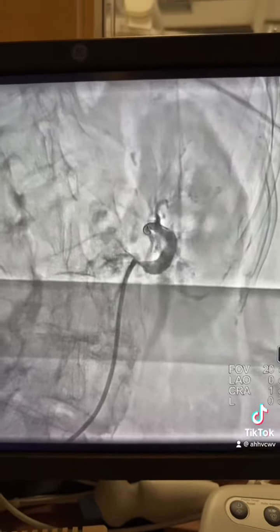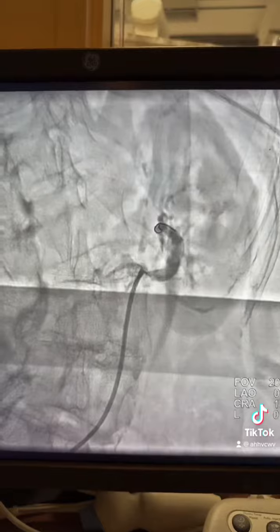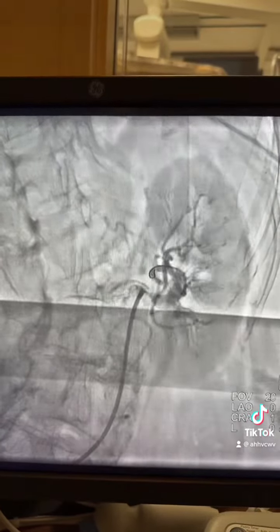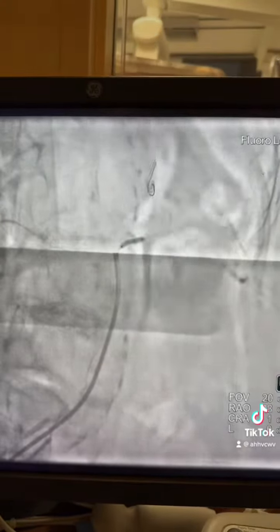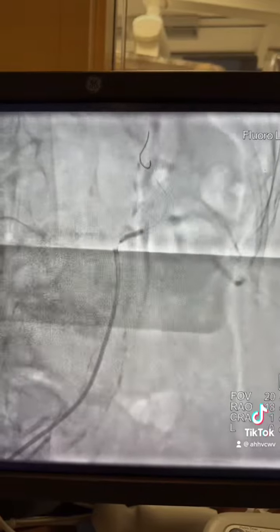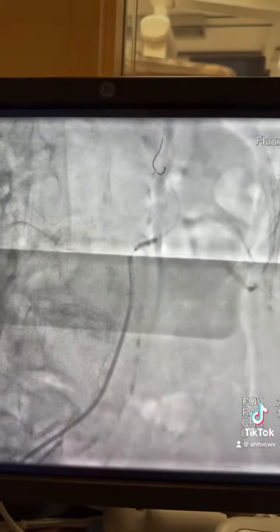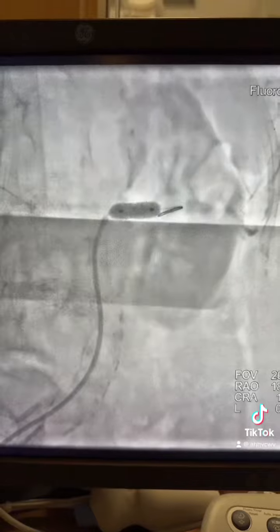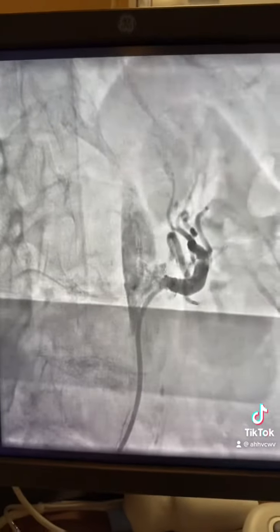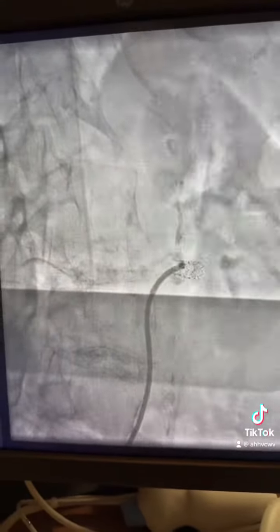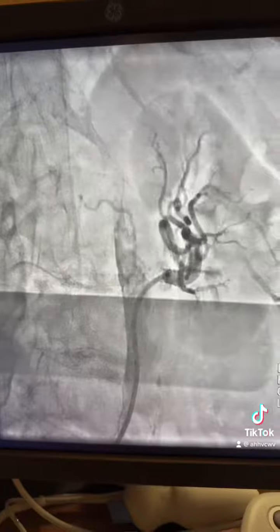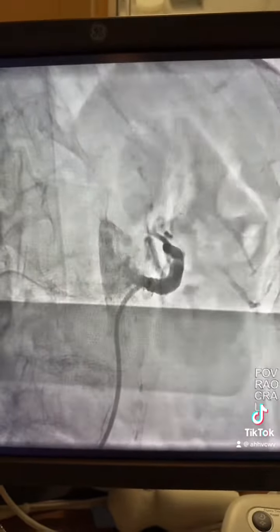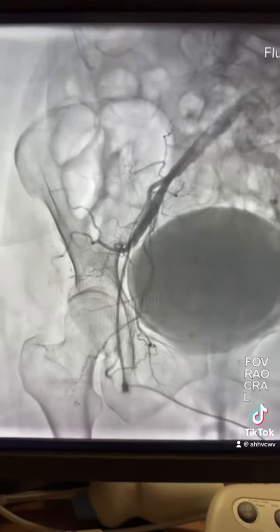The left renal artery was tight. A run-through wire and a 6 French guide with a 2.5 balloon stent was deployed, and the final results were perfect — satisfactory, with nice dye reflux into the aorta.